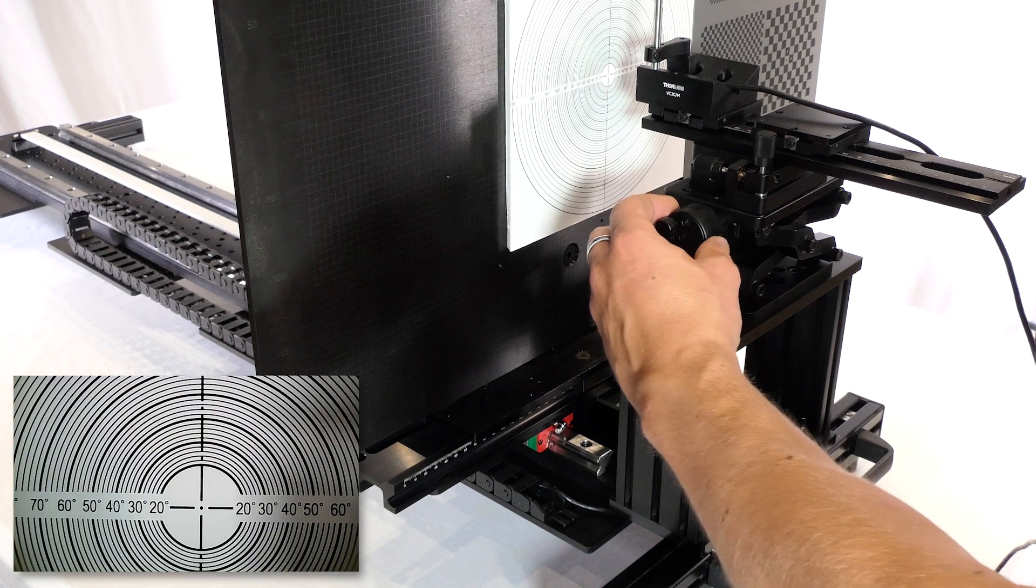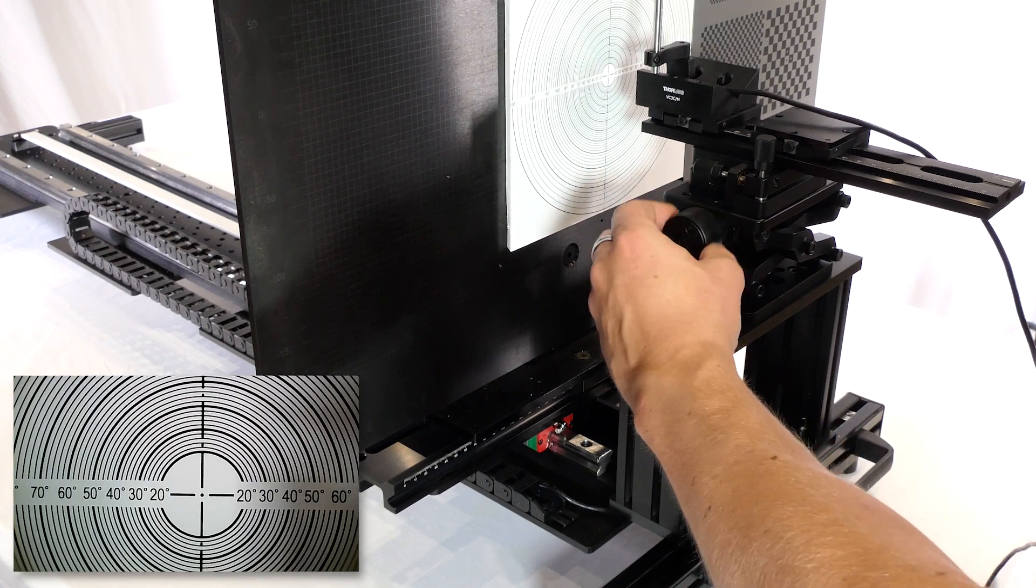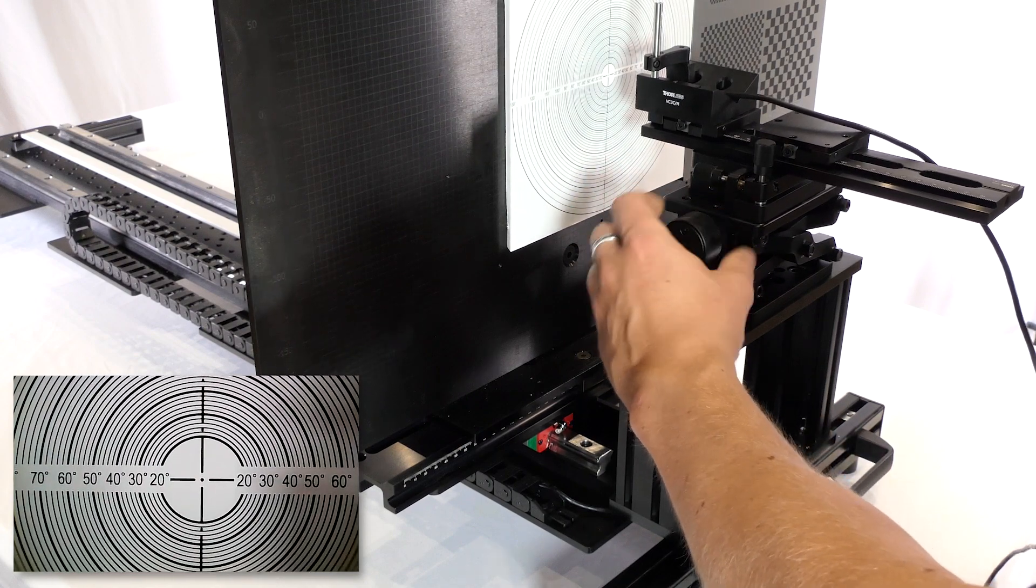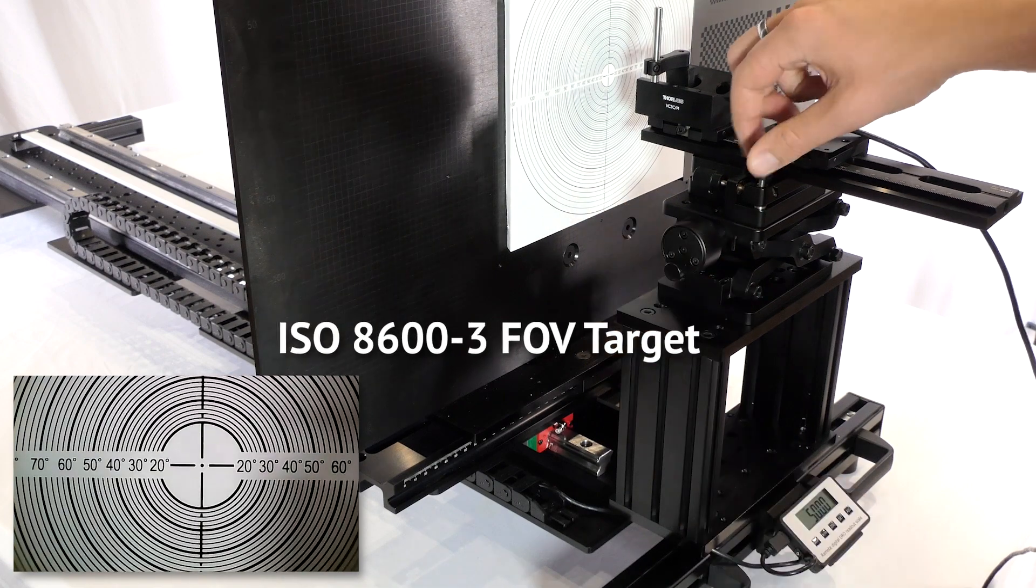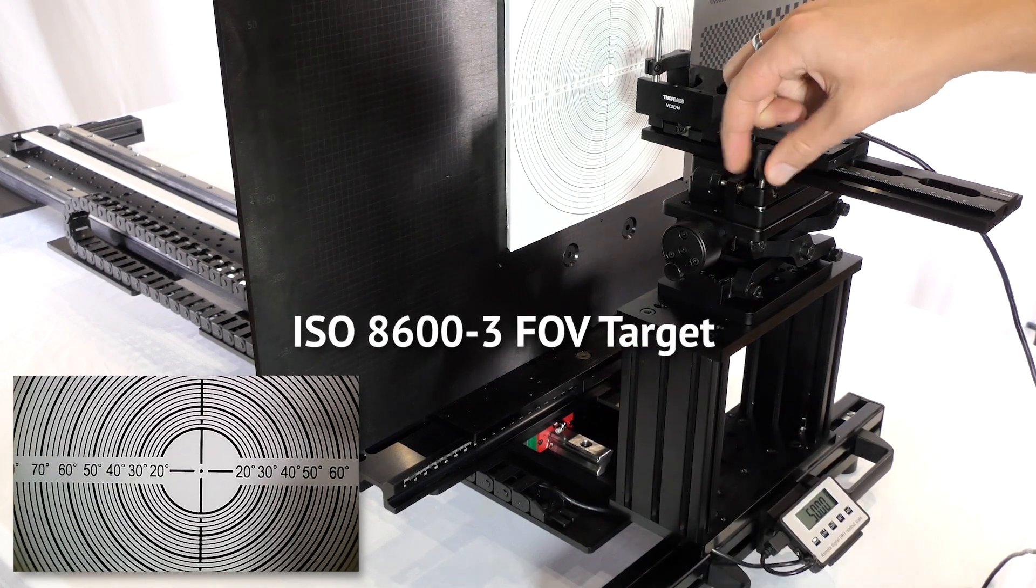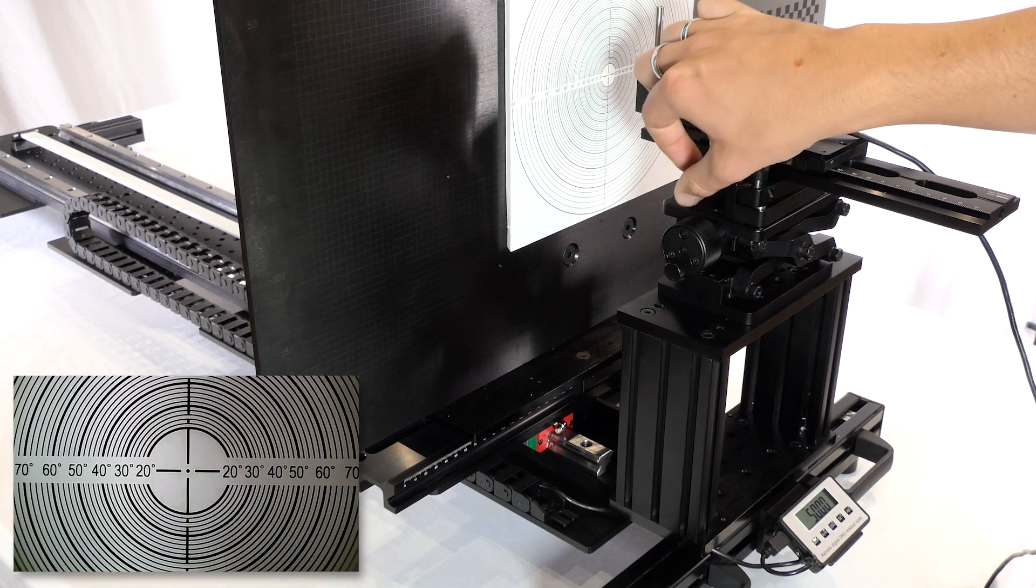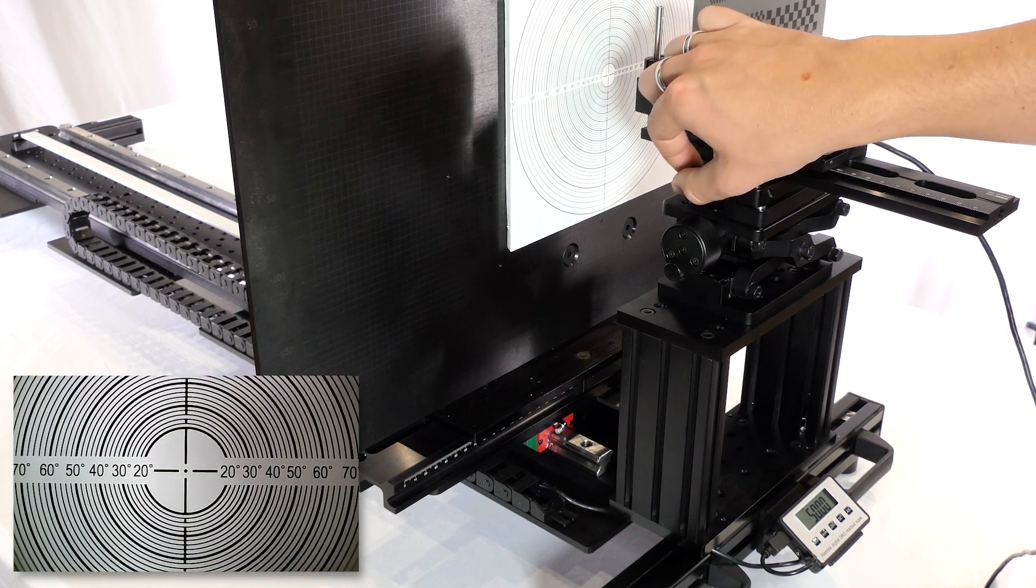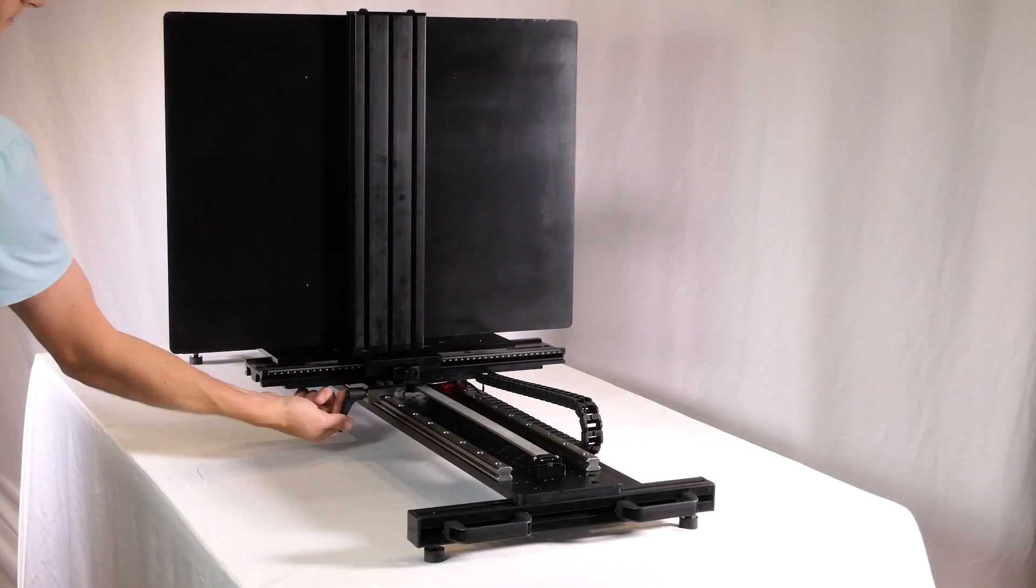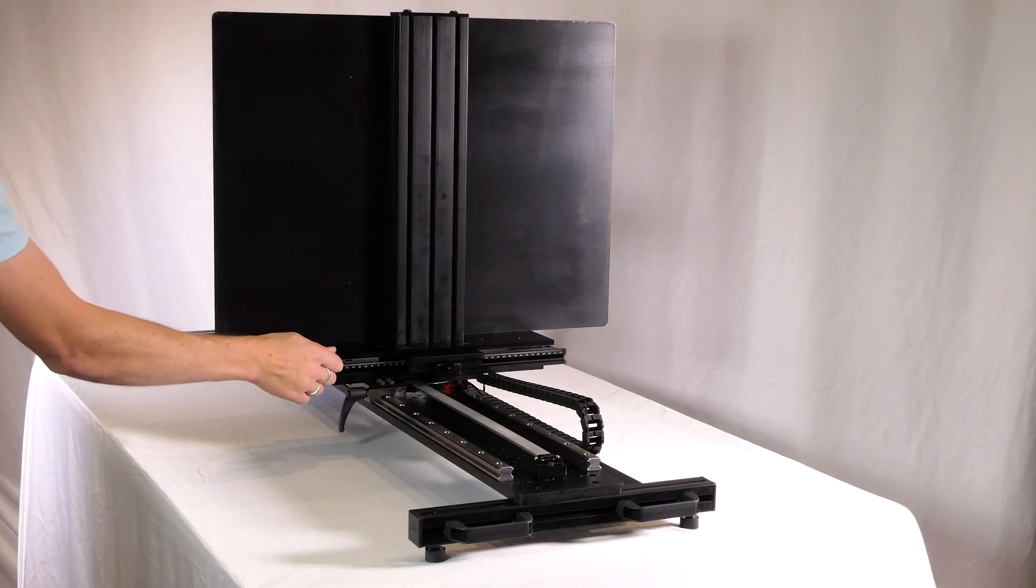Perform a variety of tests for endoscopes and endotherapy devices such as ISO 8600-3, which calls for determination of field of view and direction of view. Securely lock your positions in place with the included brakes.